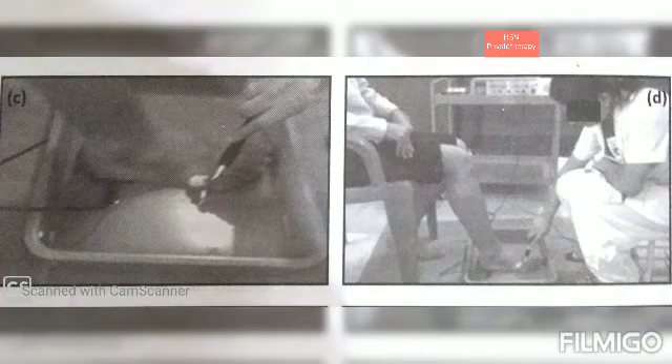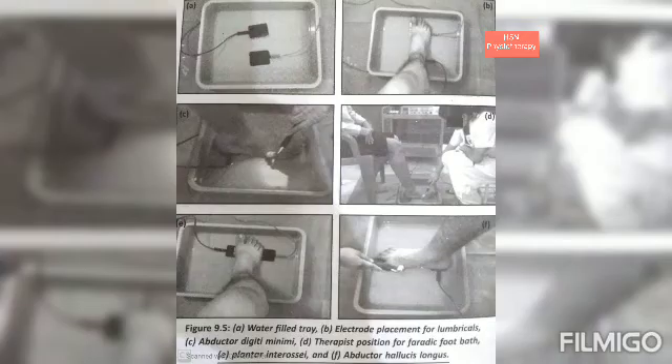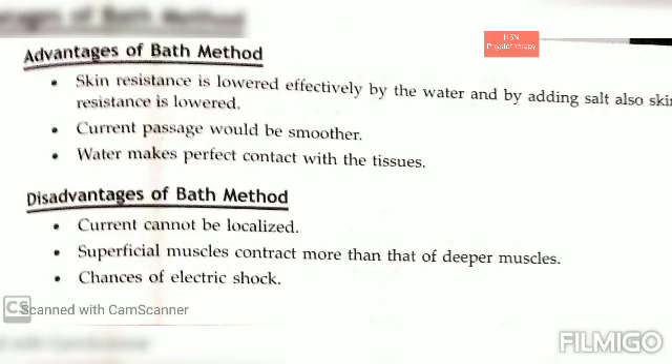The apparatus required will be an electrical stimulator, carbon rubber electrodes, a metal electrode or pen electrode, connecting leads, a tray filled with water, and a rubber sheet. The position of the patient will be sitting on a plinth for back support.